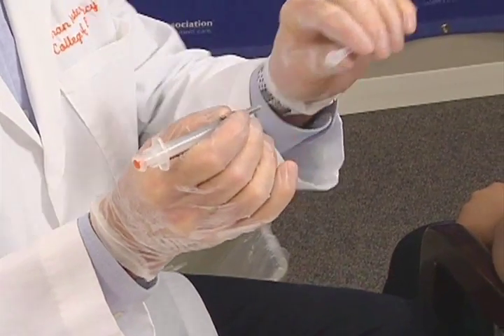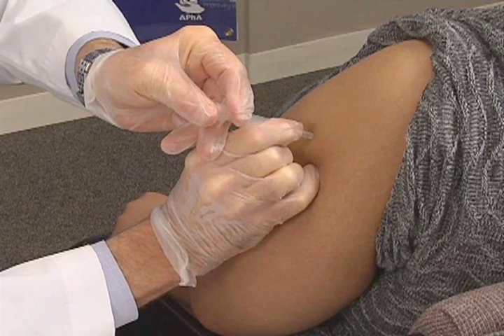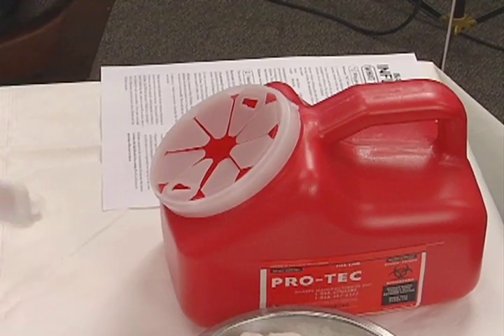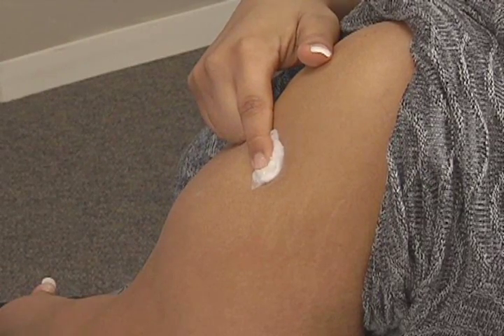Hold the syringe near the hub. Insert the needle at a 90 degree angle all the way to the hub of the needle. Maintain contact with the patient at all times. While supporting the patient and the syringe, depress the plunger in a smooth and coordinated manner. Immediately activate the safety device, then dispose of the syringe and needle in a sharps container.